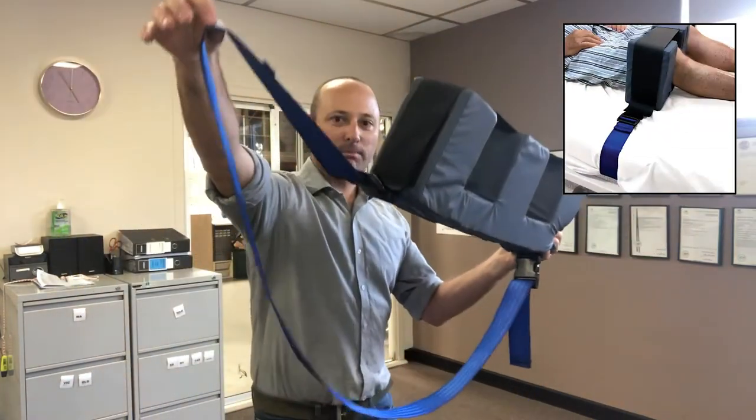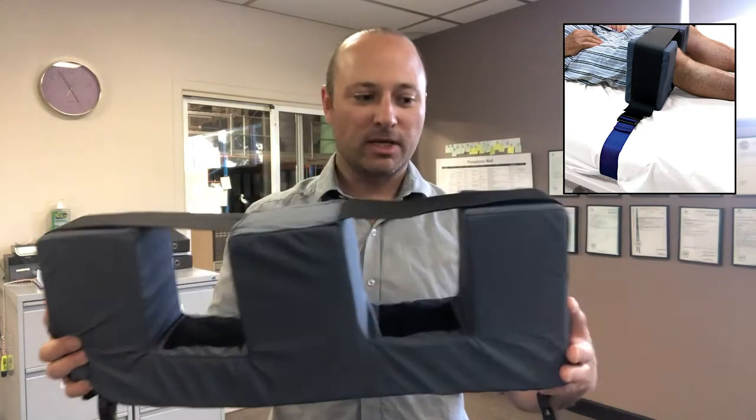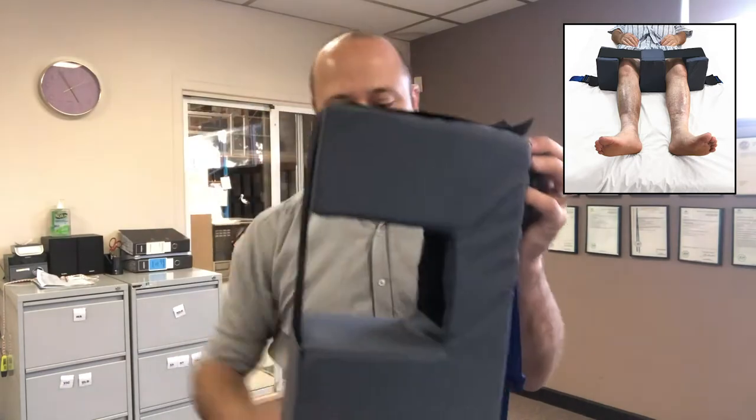There's a long strap with buckles on each side to attach it to the mattress. There are velcro parts here to hold the legs in place.